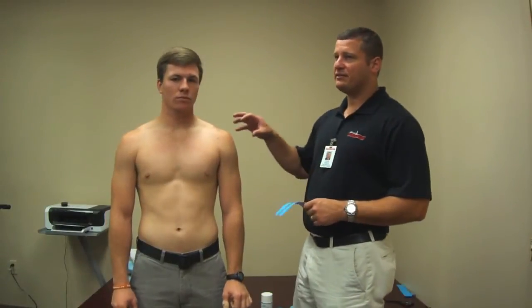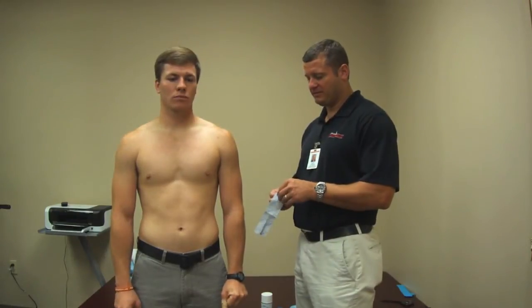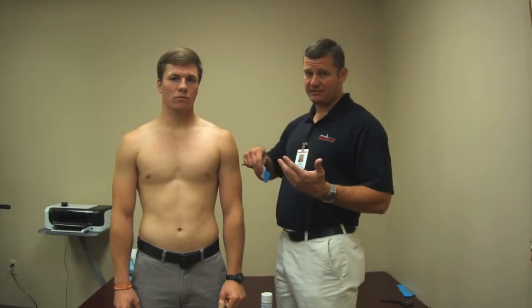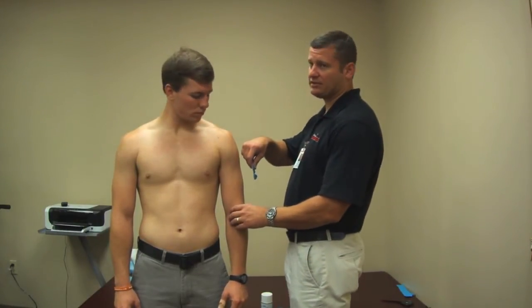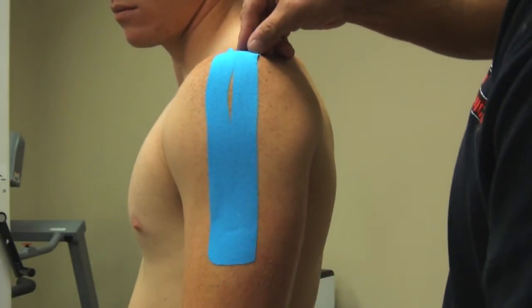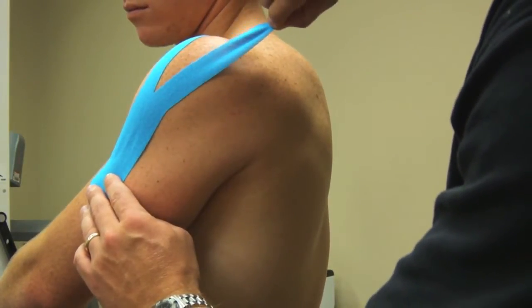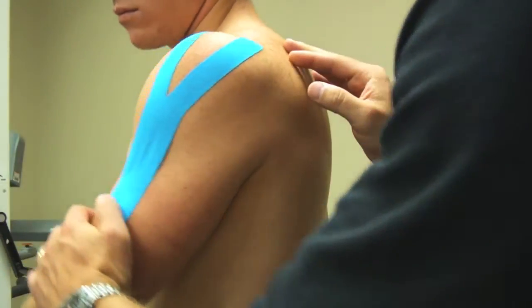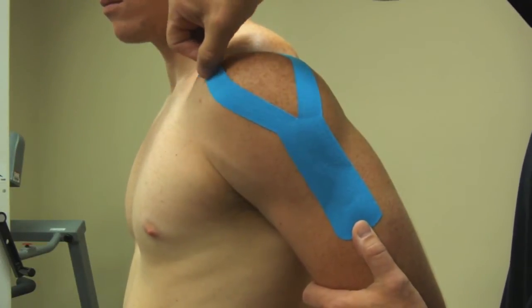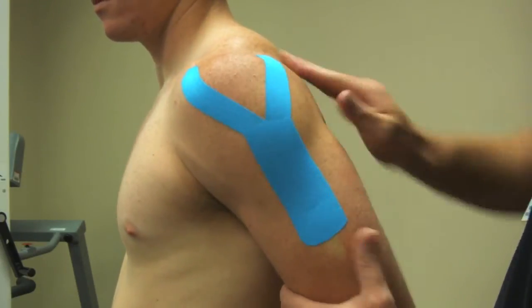This is for somebody that would have a rotator cuff tendonitis or impingement of the shoulder. The process with inhibiting a muscle is you want to go from the opposite of the muscle fibers. So we're going to go what's called distal to proximal, applying the tape down. For the rear deltoid, bring the shoulder forward and put just a little tension on the tape. And then for the anterior, again, you're going to put on a little stretch and put a little tension on the tape. Activate the glue by rubbing it and getting it hot.